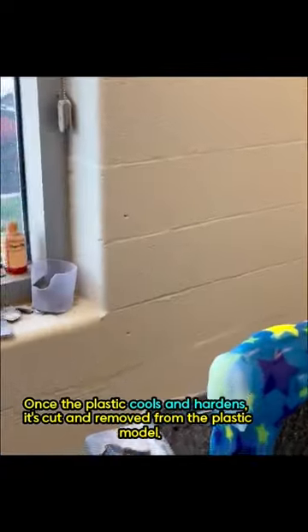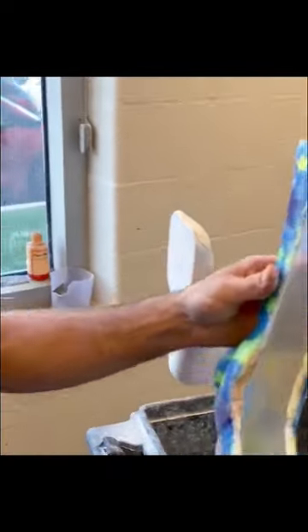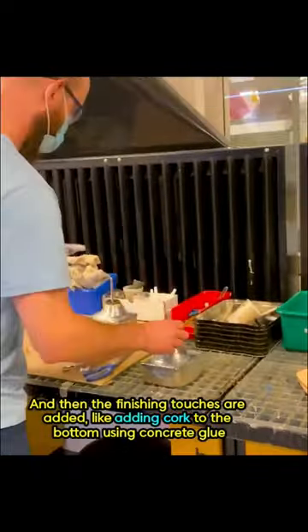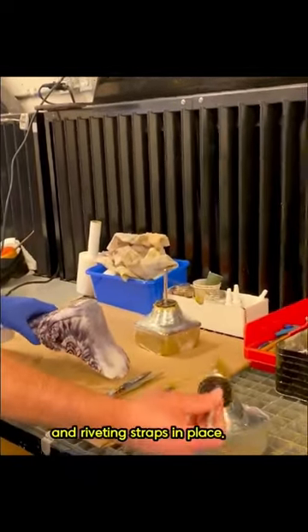Once the plastic cools and hardens, it's cut and removed from the plaster model. And then the finishing touches are added, like adding cork to the bottom using contact glue and riveting straps in place.